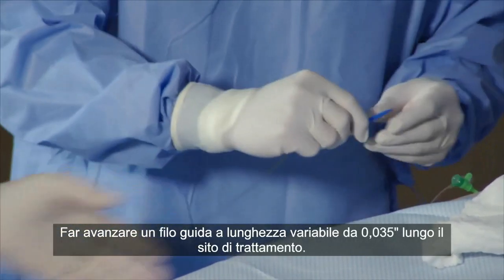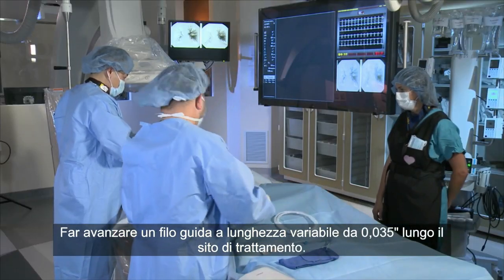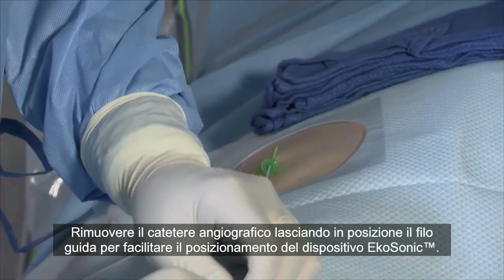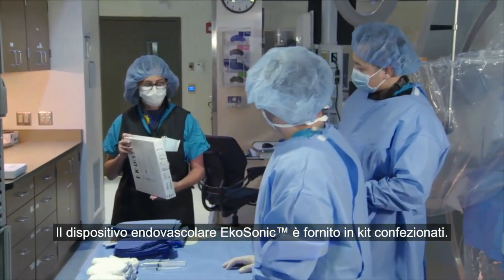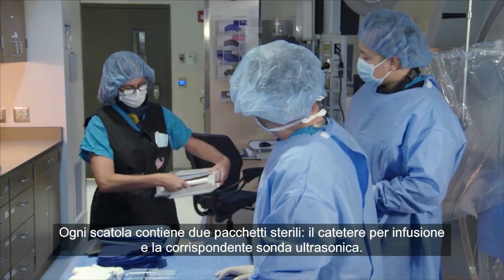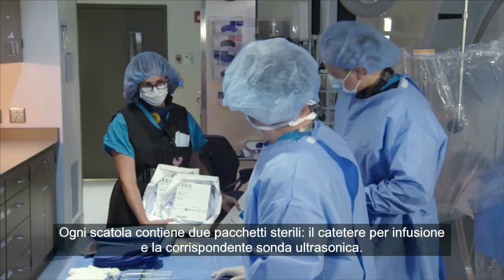Advance an 035 exchange length guide wire across the treatment site. Remove the angiographic catheter, leaving the guide wire in place to facilitate placement of the EKOSonic device. The EKOSonic endovascular device comes packaged as a kit. Each box contains 2 sterile packages, the infusion catheter and the corresponding ultrasonic core.